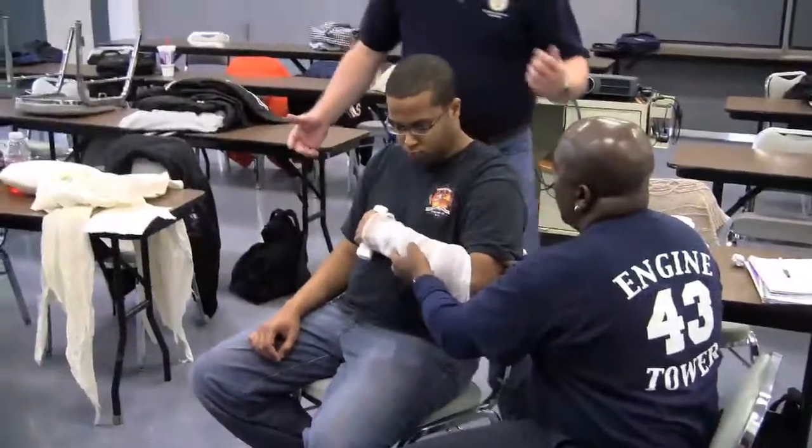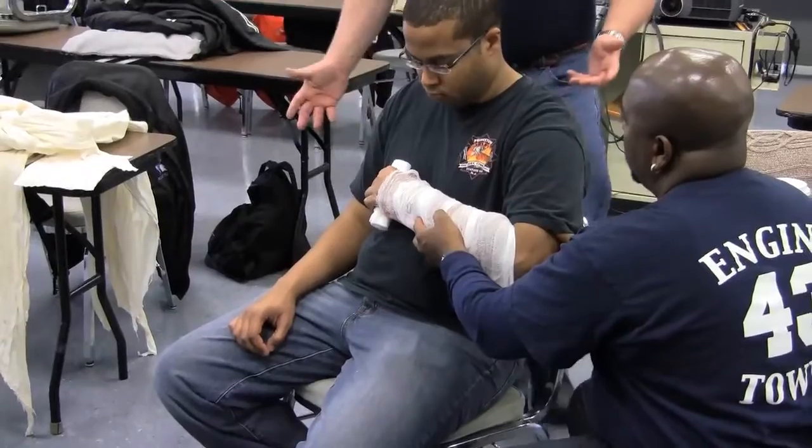Just this time, you're putting that knot here and you're covering the board.